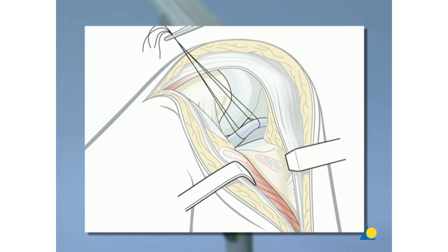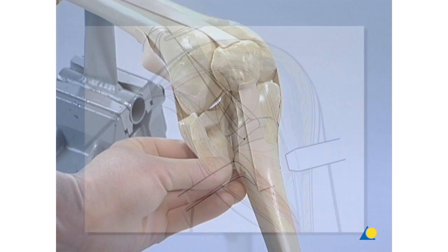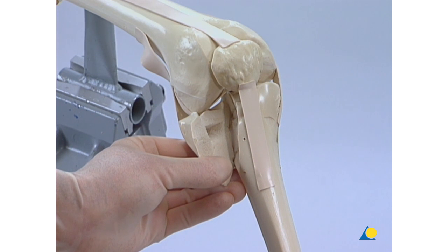In the clinical situation, the knee joint is opened by a horizontal arthrotomy distal to the meniscus. If the meniscus is torn, it's now advisable to place two or three resorbable sutures into the rim of the tear for later reattachment. To fully appreciate the extent of the damage to the lateral condyle, the condyle is gently opened through the anterior fracture line.